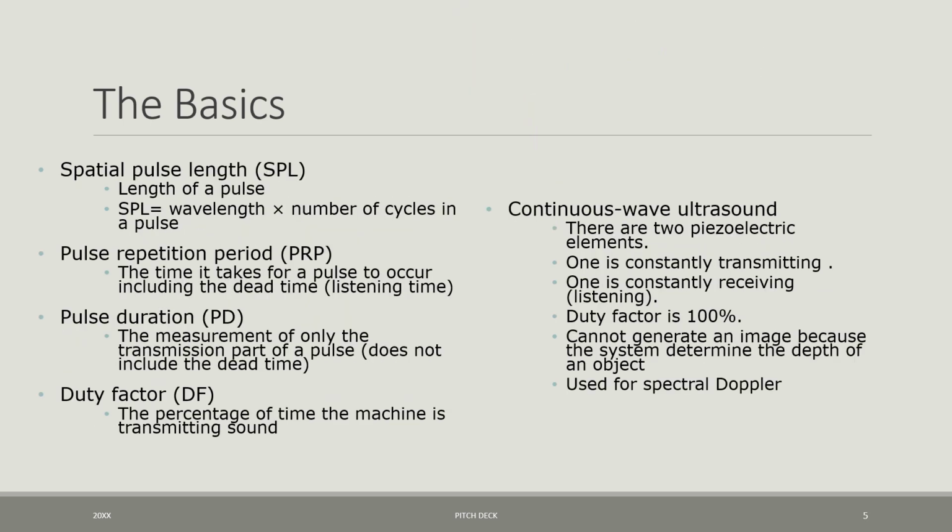Now, a few other things that we won't go into as in depth as you would in, say, your physics instrumentation course, but deserve a quick review, are the characteristics of pulse ultrasound. So in the instance we just described before, we have a transducer. That transducer has piezoelectric elements. Piezoelectric elements expand and contract when they're stimulated with a voltage.